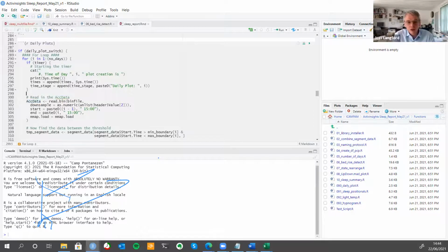It's the sort of thing where we evolve the specification based on what people's needs are. If you've got a specific need in this area for a project, then talk to us, and there are modifications we can do that other people can benefit from as well. One of the challenges, if you're not working in a particular area, is I don't know what summary measure of light exposure is going to be most useful. Some sort of aggregate measure of lux on a day, or time spent above a certain value, trying to look for indoor or outdoor conditions, or dark light conditions within the house.